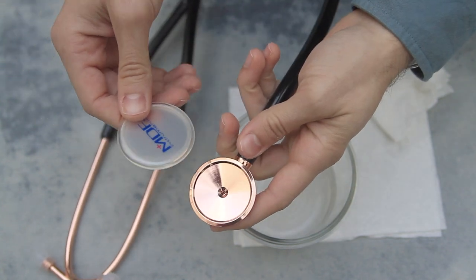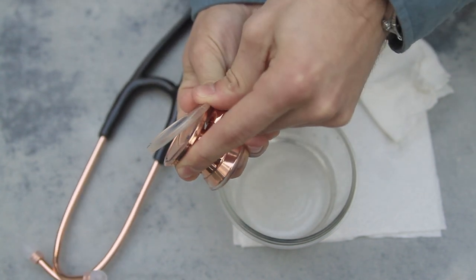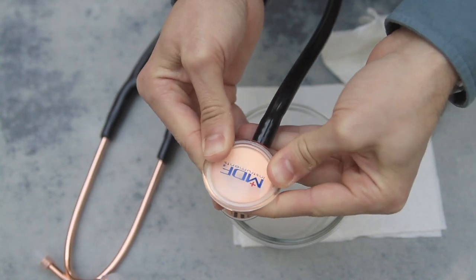To install the retaining ring and diaphragm onto the chest piece, place the lip of the ring under the edge of the chest piece. Continue to press the ring along the edges of the chest piece until it snaps into place.